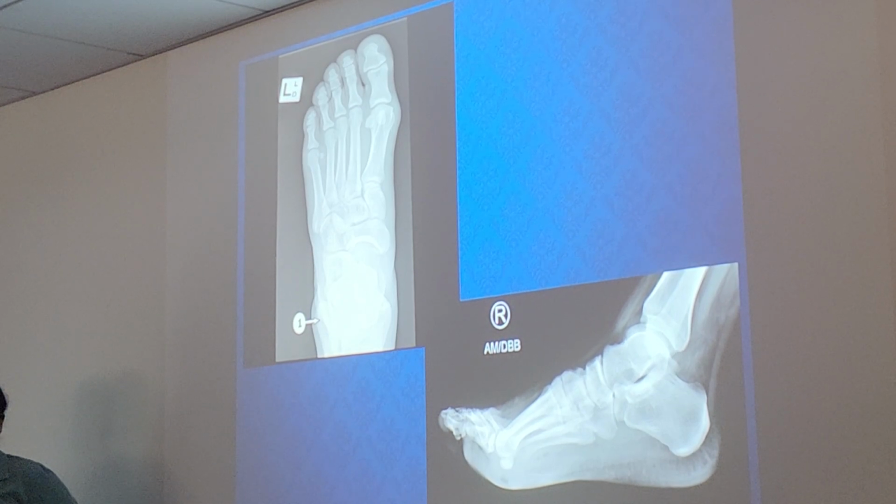So how are you comparing that middle to the middle of the body? When you say medial, it's the middle of your body. On the foot, which one is the medial side? This side is the medial because it's towards the middle of my body. Right, so if I did your right foot X-ray, the X-ray would enter from this side, the medial side, and exit the lateral side. Thank you.